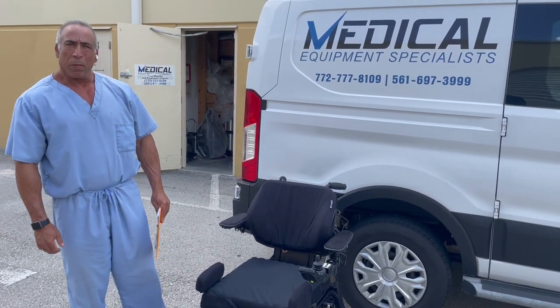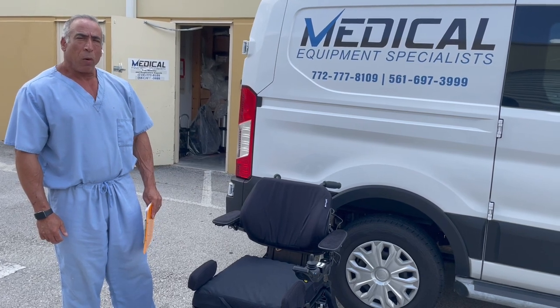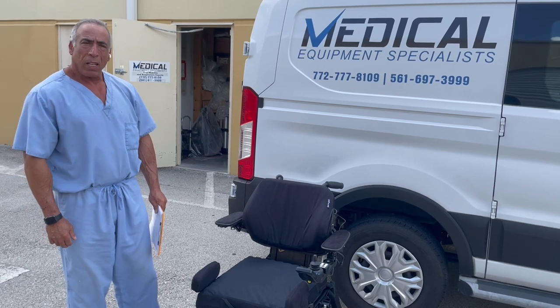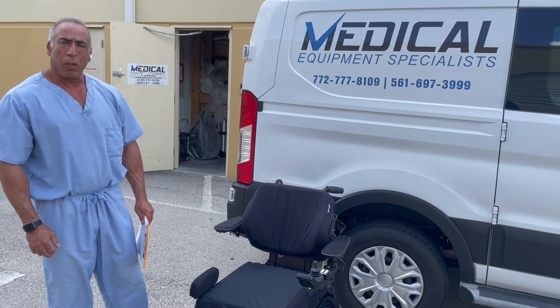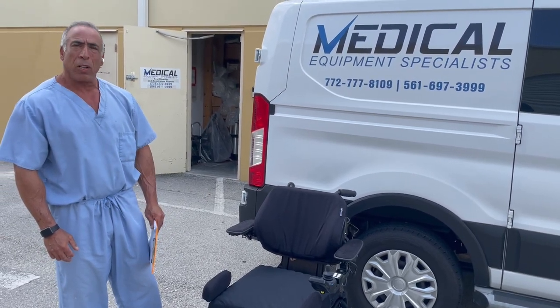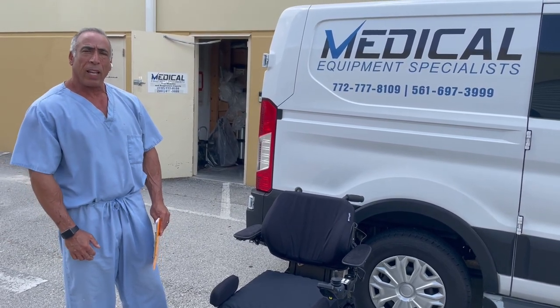Hi, I'm Jeff, Medical Equipment Specialist, ATP on staff. A question we get a lot from our mobility clients is: my chair died, it's stuck, and I can't move it. So today we're going to demonstrate how we put the chair in neutral so we're able to push it and get it back to the house, so you can call your service technician or us at Medical Equipment Specialists to take care of it.